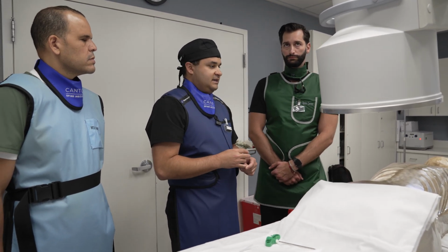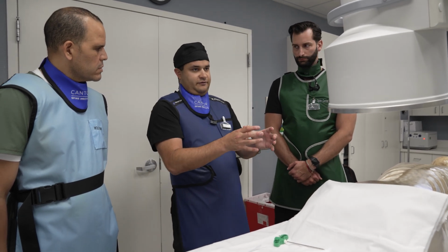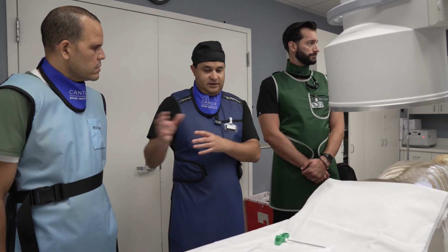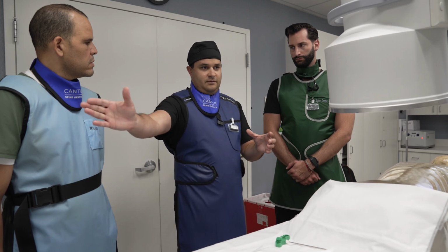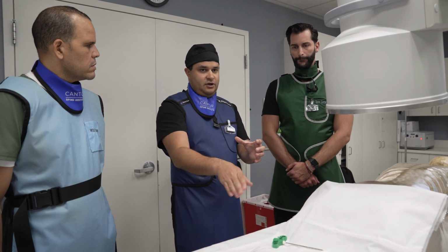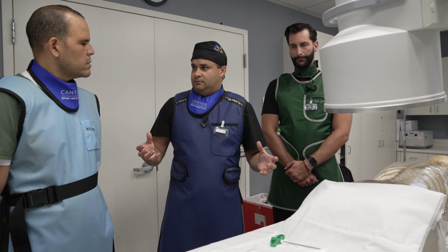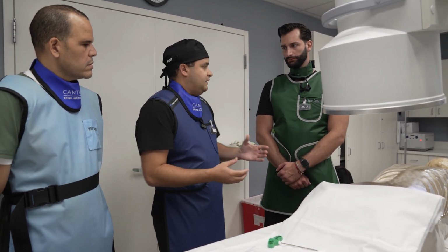Because what you'll see all the time is the patient has a central disc bulge at L4-5, right? And whatever doc did their previous injection didn't look at the MRI, I don't think, because it's a pretty central disc bulge. The L4 nerve's already out before this disc bulge is there. It's not compressed. You're actually compressing the L5 nerve root on the way down to the next level. They get an L4-5 epidural. Patient comes in and says the epidural didn't help. Well, you didn't treat the nerve that has the compression. That nerve was fine, right?